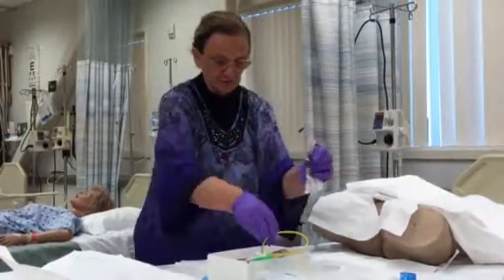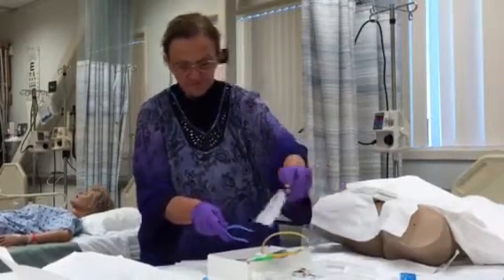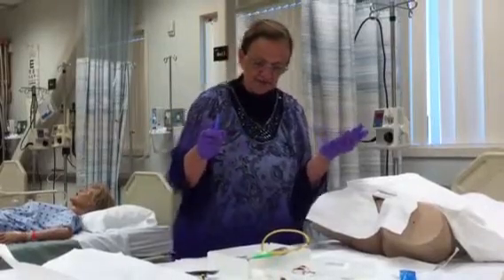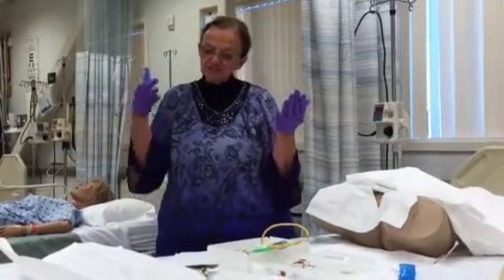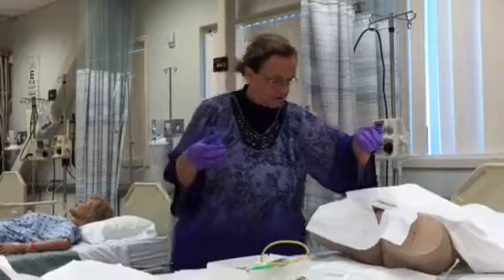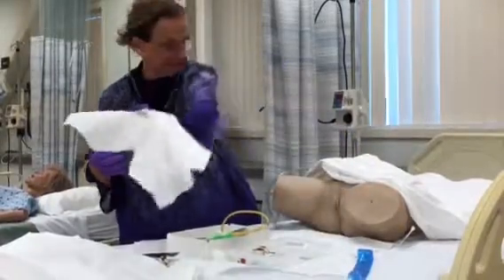And I'm going to go ahead and pour it on my cotton balls. And then when I'm done with this, I'm just going to dump it. You see how I drop? I don't place, I just drop. So now I'm going to deem one hand sterile and one hand contaminated. I always use my dominant right hand as my sterile hand so I don't forget. Now this hand is going to become dirty because I have to hold up the labia. There's this lovely drape that I adore, and it's in my way, so I'm getting rid of it.